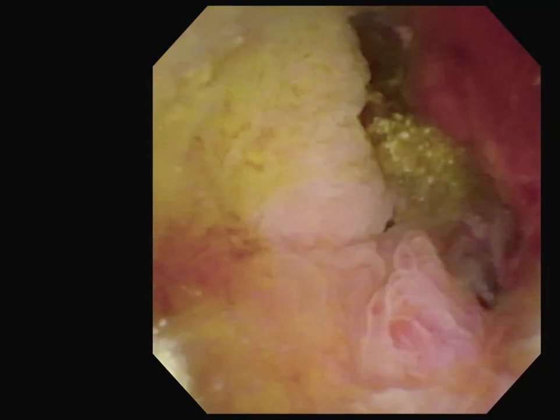We identified a two to three centimeter remaining gallbladder containing a single two centimeter gallstone, contrary to the CT findings. The stone was mobile, and we were able to navigate our scope down through the cystic duct into the common bile duct. Within the common bile duct, there was a single patent biliary stent and patent sphincterotomy.